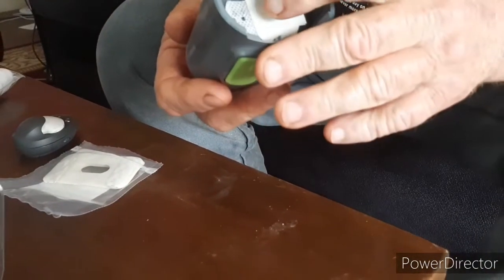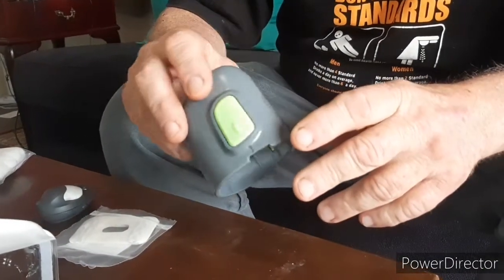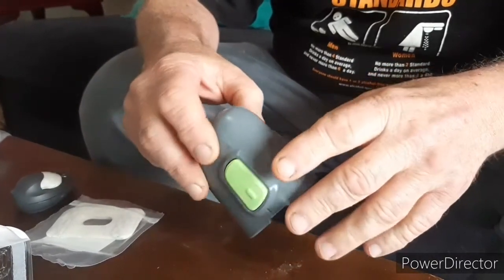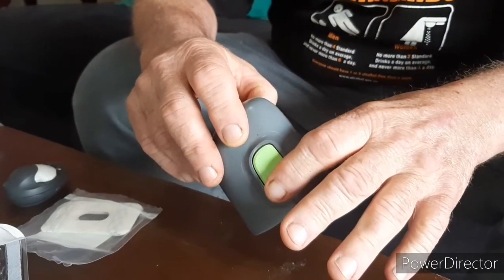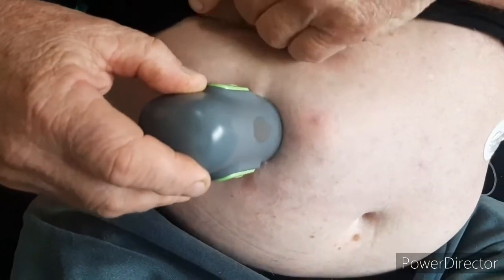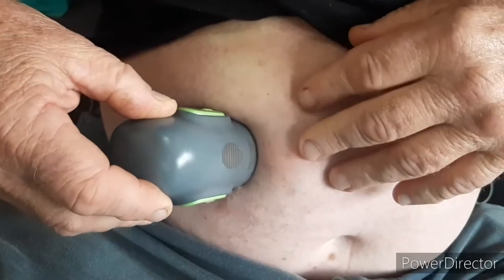Now you've got the needle and the self-adhesive pads. Sight it on your stomach, place your fingers on each side and then press both buttons simultaneously. Always make sure it's positioned well below the ribs — about two to three fingers below — otherwise it'll be a very painful experience.